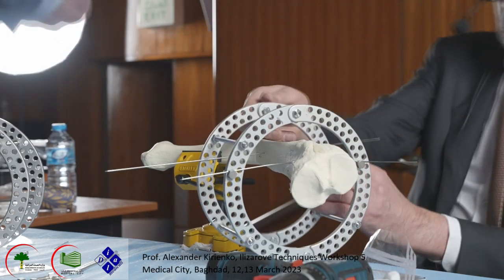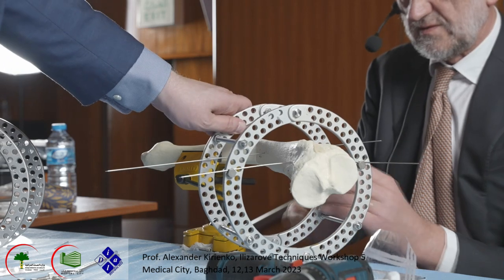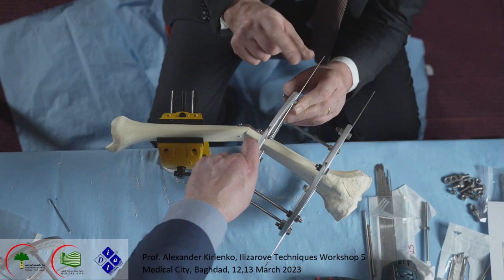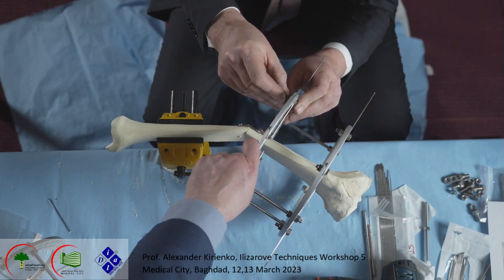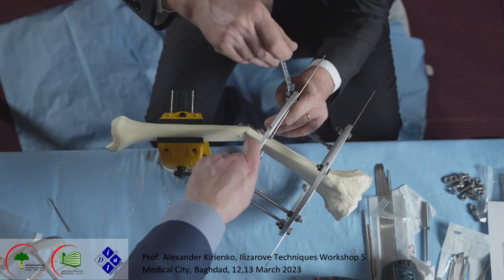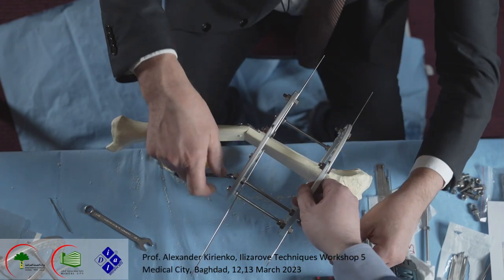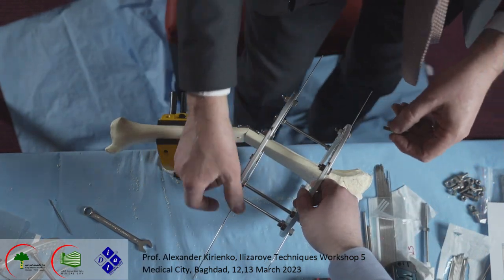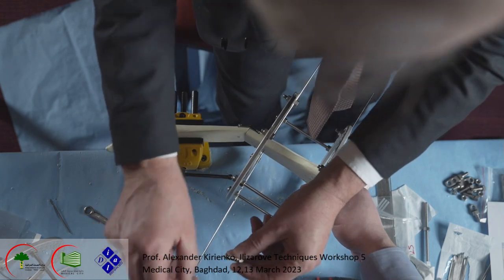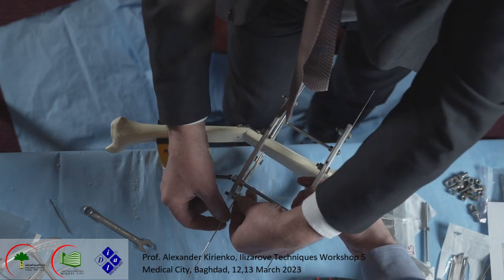Okay. We look at the lateral view and attach a distal wire. Here we may need a washer, because like I said before, the wire should never be bended.